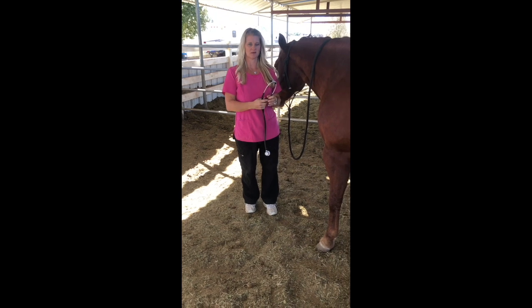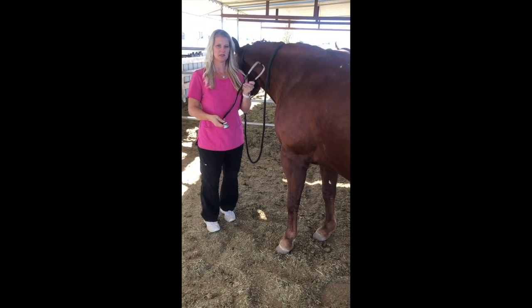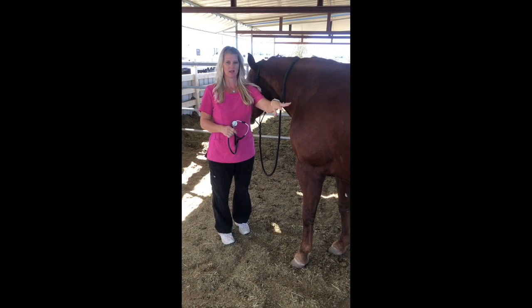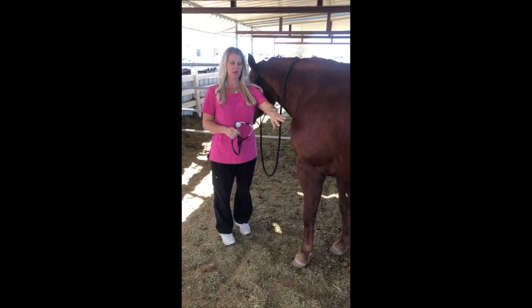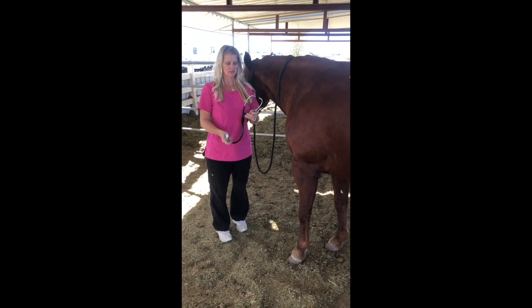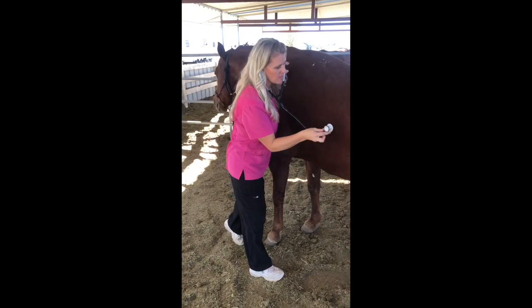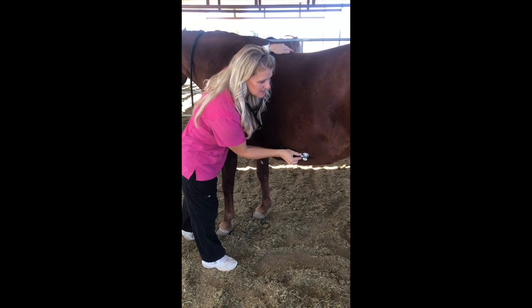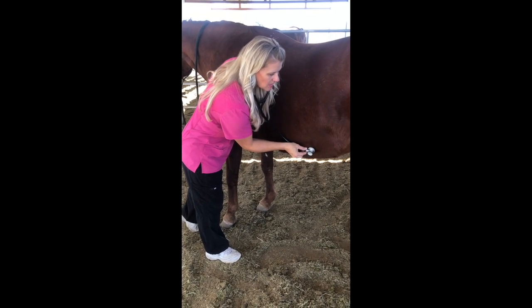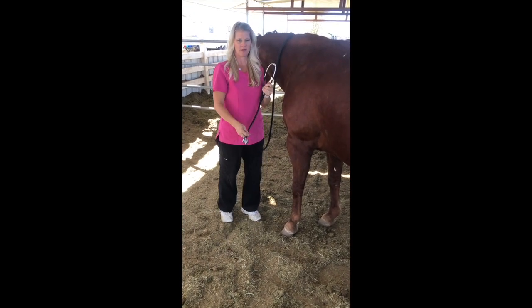Okay, listening for gut sounds. One of the things that you can do is take your stethoscope and you're going to be listening for any type of rumbling or gut sounds that are going on in their digestive system. If you aren't able to find any sounds, that could be a sign of colic. So this is one of the methods that you can do. Just take your stethoscope here and just listen. And you should hear gurgling or any kind of movement going on in there.